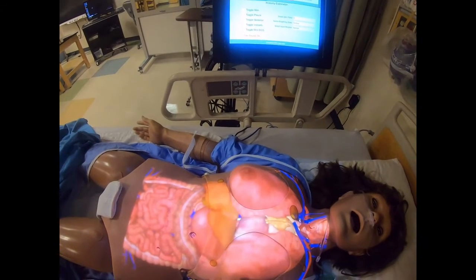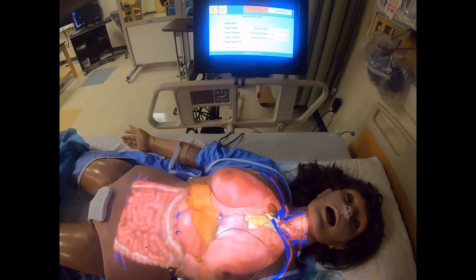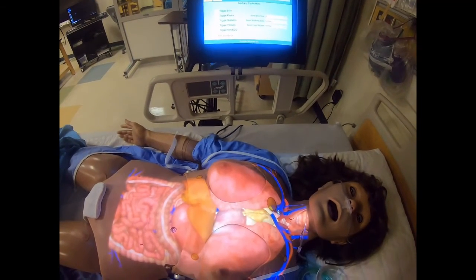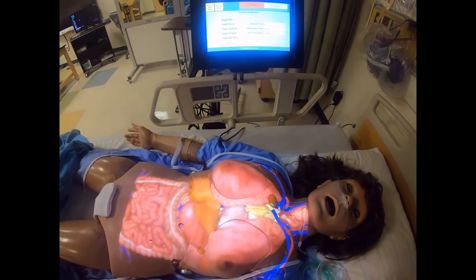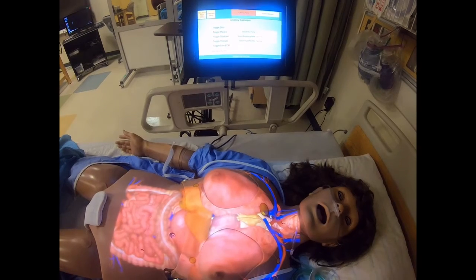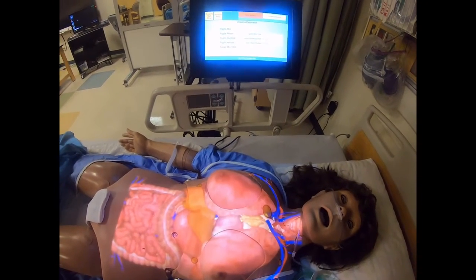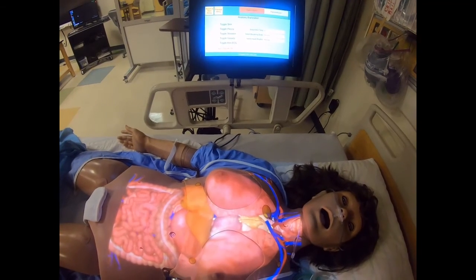How might my patient's end-tidal CO2 drop? Well, hyperventilation. If we start breathing really, really fast, my end-tidal CO2 can drop below 35. And what we do is we encourage our patients to slow their breathing down so that they can bring that back to a normal level.